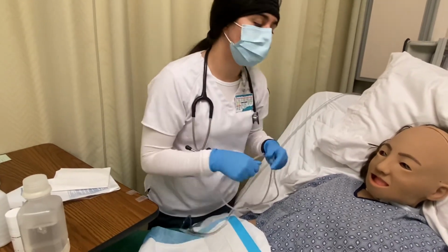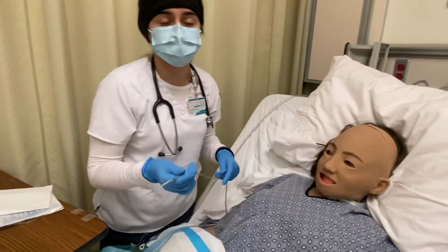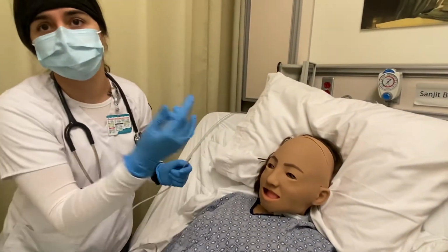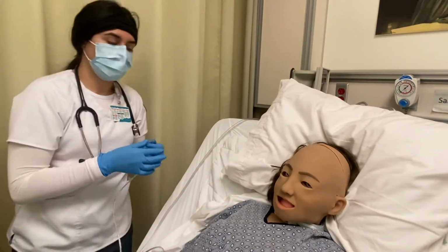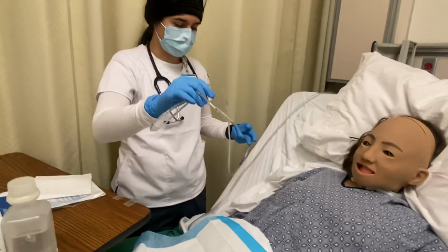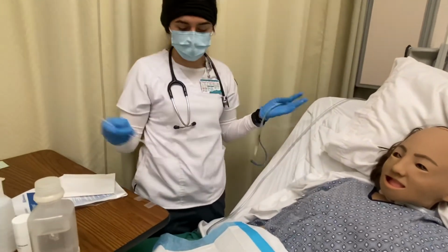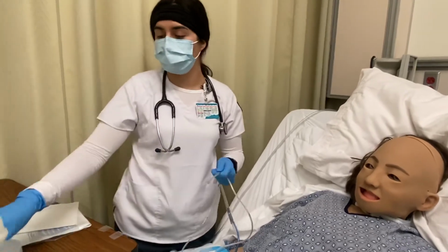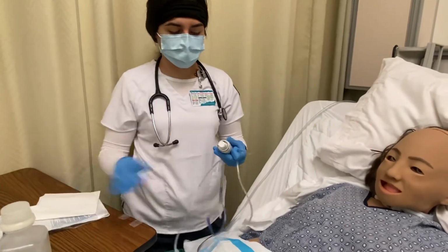Then I would check the nose, and double check that there's no obstruction in the nose, and see if there's a better nostril to use. Okay, so now before I get started, I would go ahead and lubricate it.